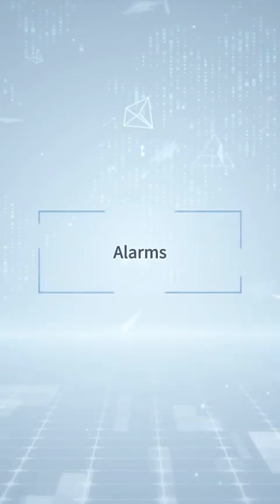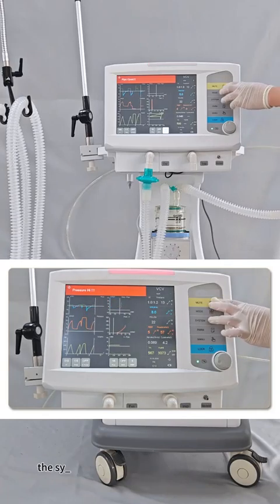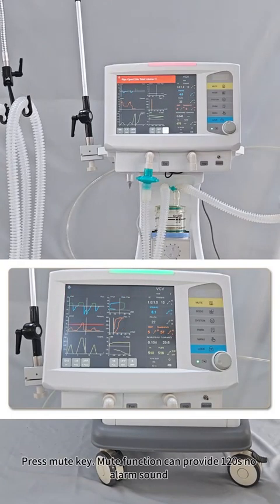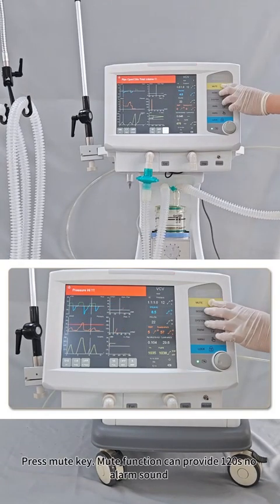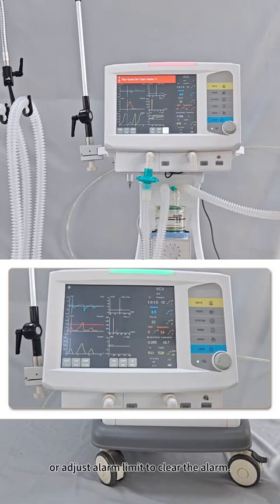Alarms. When there is a pipeline disconnection or other problems, the system will prompt a warning on screen. Press the Mute key. The mute function can provide 120 seconds of no alarm sound, or adjust the alarm limit to clear the alarm.